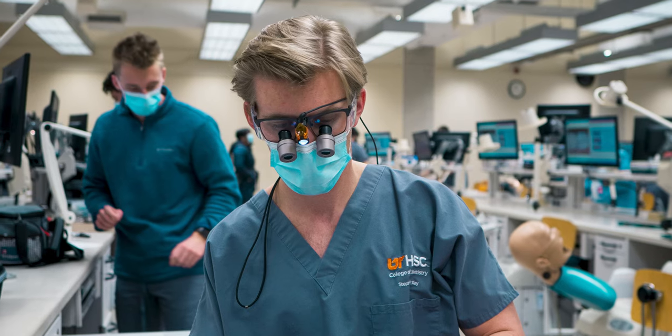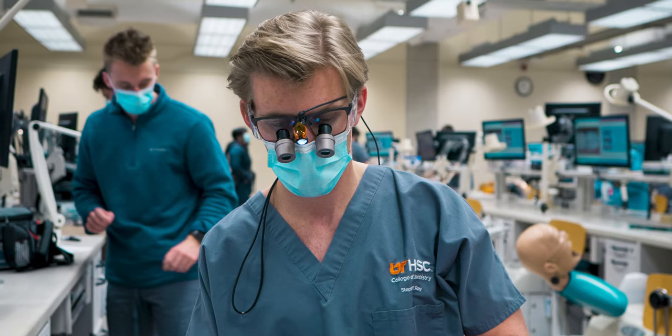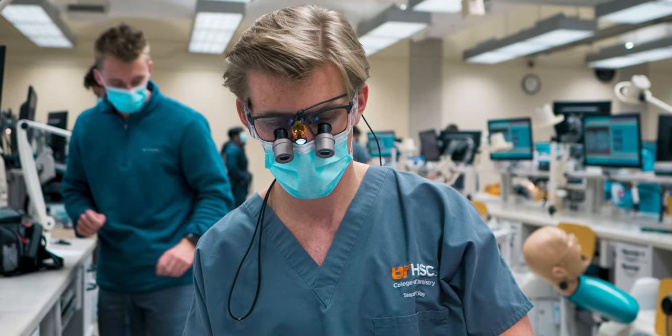I want to make this video pretty short and quick, but I'm going to be talking about my loops today, why I chose them, and maybe some things that you should consider when you're buying your first pair of loops.